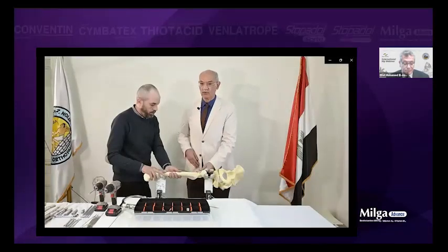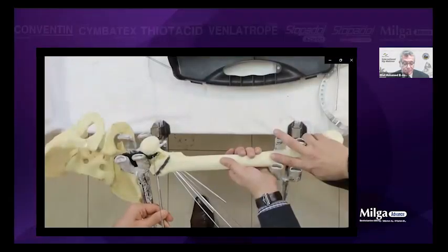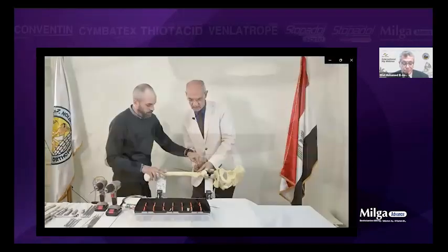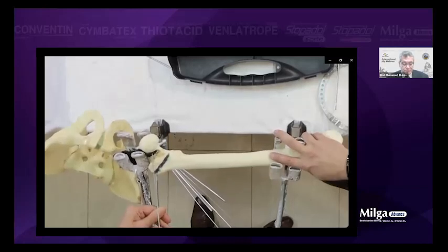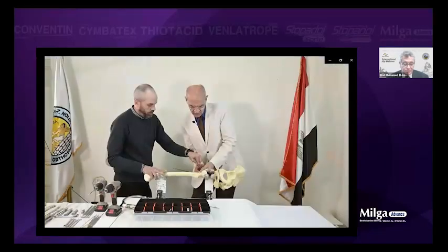Take care that sometimes it's a very soft bone, so it's better to avoid too much heat. So we go manually, bit by bit. You see, it's okay. See the whole length, till we finish the serrations. Yes, we finished the serrations.